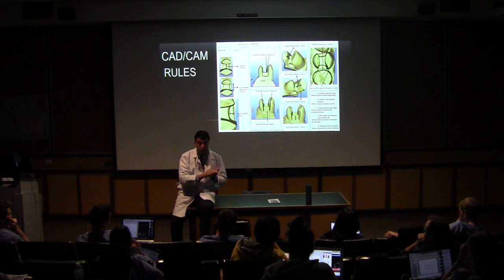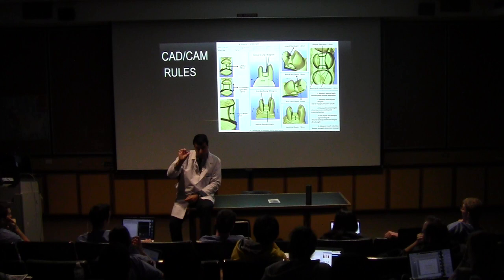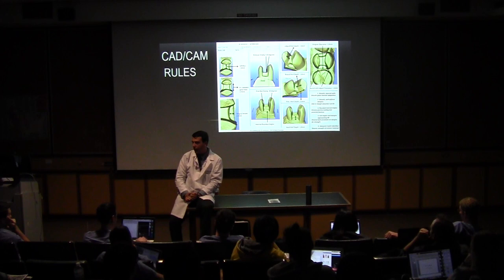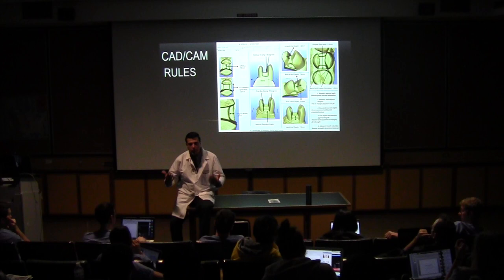Minimal reduction or thickness would be 1 millimeter. Ideal, 1.2. This is the universal rule for ceramic, all right? So reduction is the second most important rule. Then you start thinking, well, wait a second. I remember Dr. Porter mentioned the clearance. Why is clearance so important?